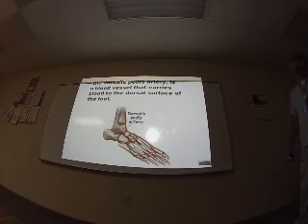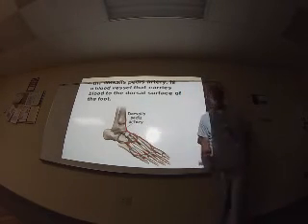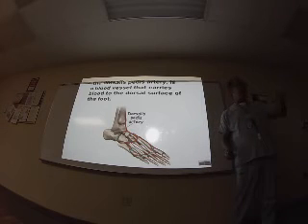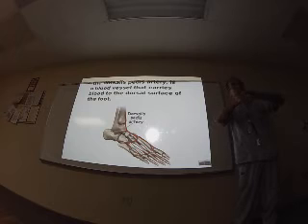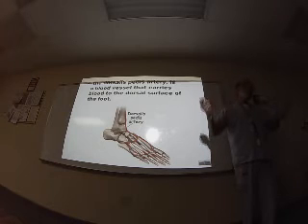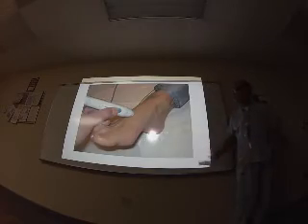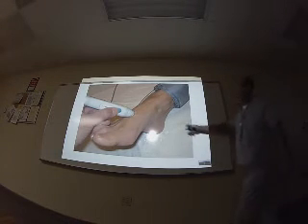The dorsalis pedis artery is a blood vessel that carries blood to the dorsal surface of the foot. There is a pulse, you can touch the pulse, it's very easy. In general, it's a very hard artery to find, so I put my finger and try to find it with the finger before scanning. I do this little trick, even though some people say the sonographer must not touch the patient. This is not true. How does the sonographer touch the patient? Okay, you can see here, this is a continuous ultrasound. This little pencil is a continuous ultrasound and it's looking.